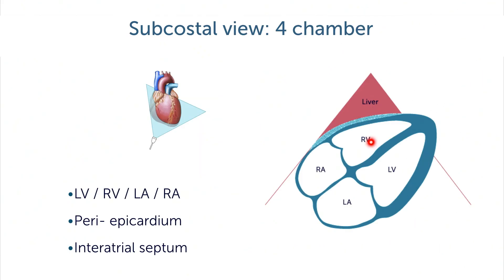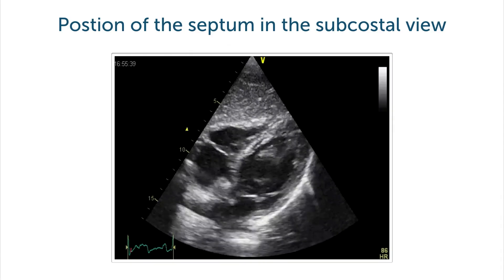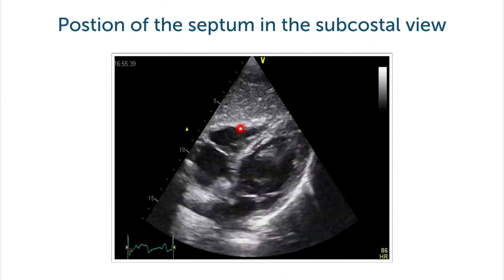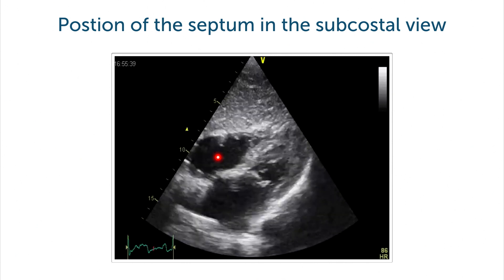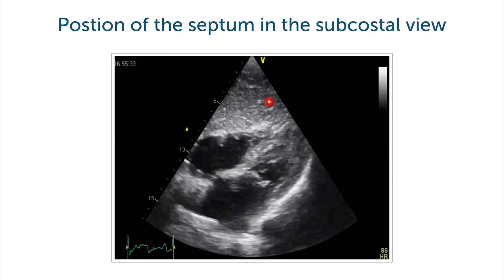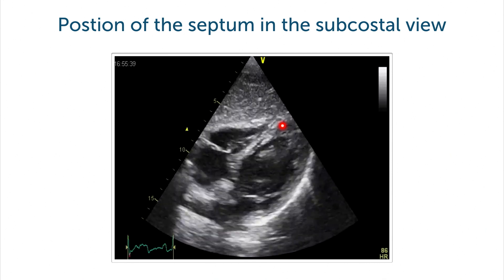As a short review, we are seeing all four chambers. The right ventricle is the one closer to the transducer. We can see the pericardium and epicardium very nicely here below the liver, and we have a very perpendicular orientation to the interatrial septum. This is a subcostal view in a healthy individual: right ventricle, left ventricle, right atrium, left atrium. Note that there is no gap between the liver and the heart.